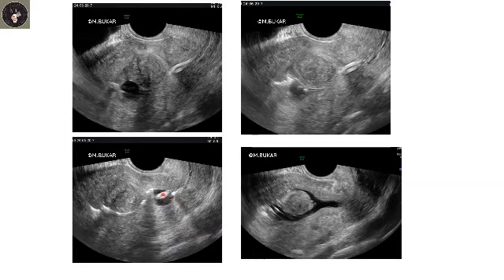The internal os. So if you now instill the fluid into the endometrial cavity, look at what you will see. We have a distended endometrial cavity, the lesion clearly outlined. When you are done, you can also withdraw the catheter under direct vision.